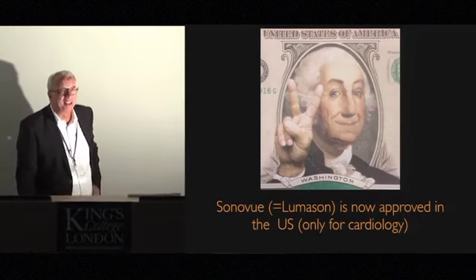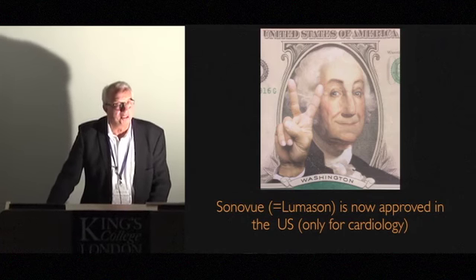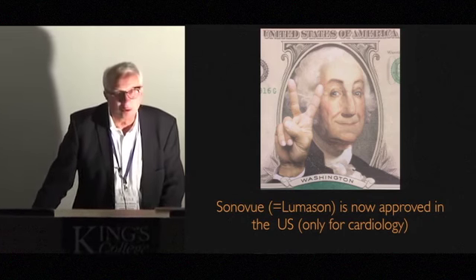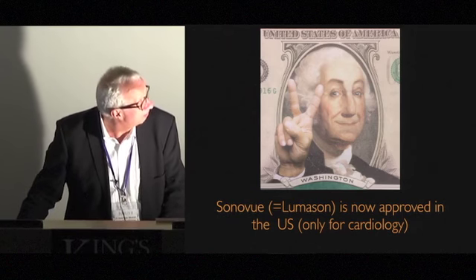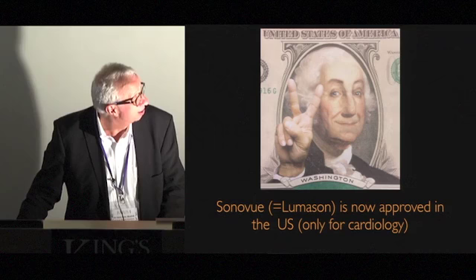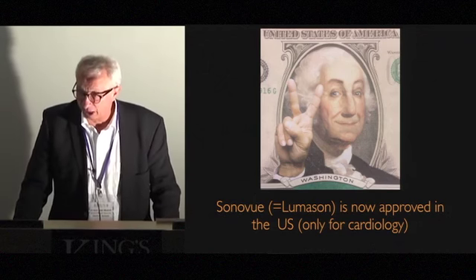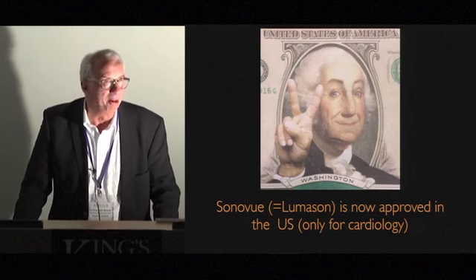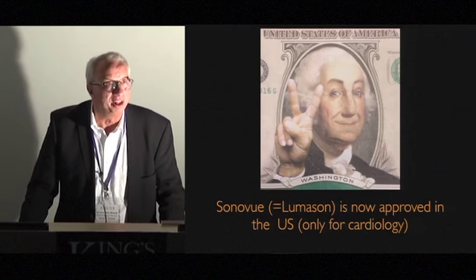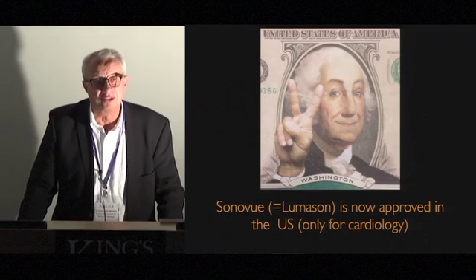We're very happy that the Americans are now joining the contrast family. I think it's now 4 or 5 weeks ago that Lumason, that is the name for SonoVue in the US, has been approved by the FDA. That is, of course, a huge step forward. As Barry Goldberg said once, the US is the third world country in regards to contrast agents, so that is no longer true because they are joining us.